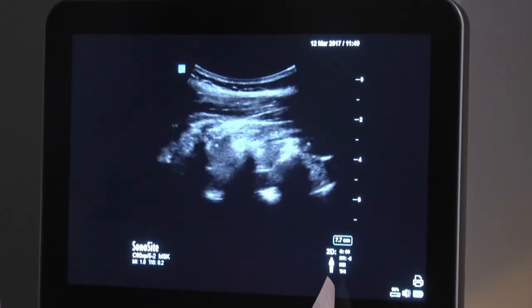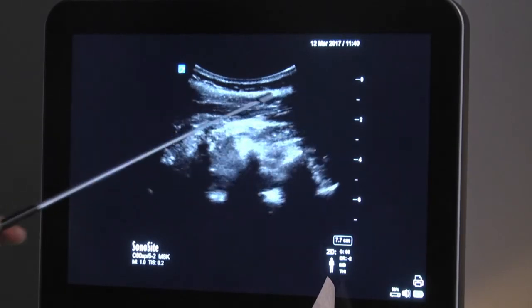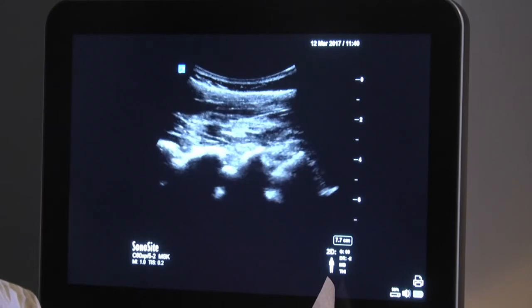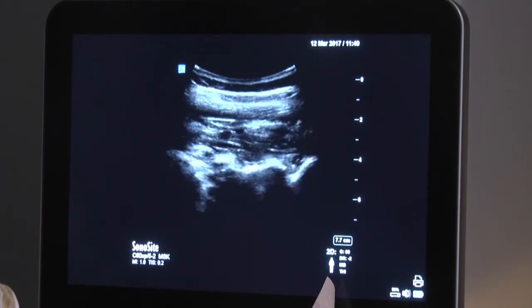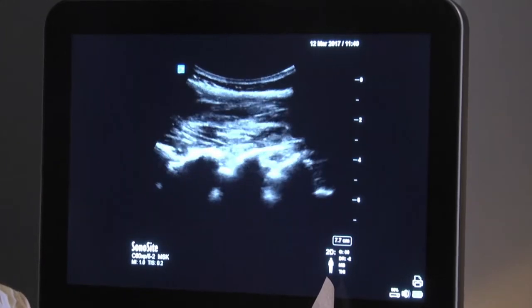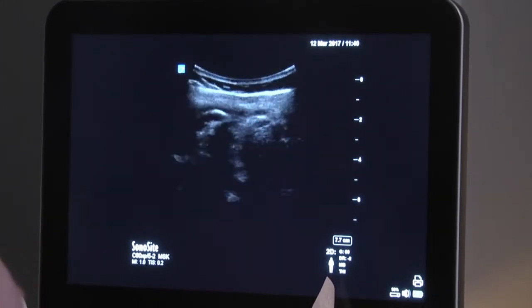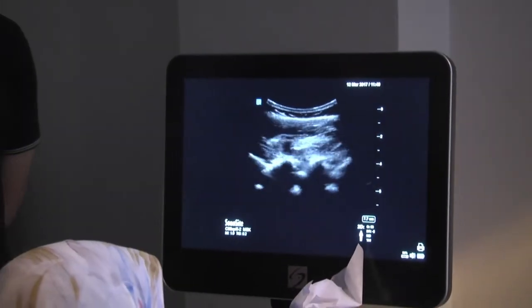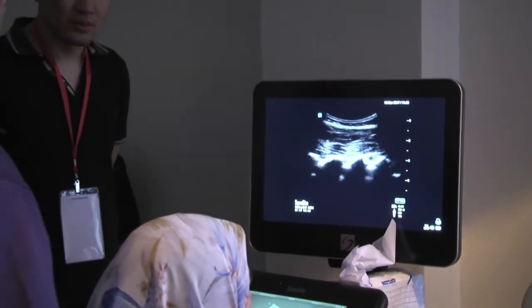So when we do real-time epidurals, we guide the needle to the ligament, and then you put the transducer down, and then we just use our loss of resistance, because the sensitivity of ultrasound is not so good today to tell me the needle tip is in the epidural space. I still have to use another surrogate, which is foolproof, loss of resistance to saline.